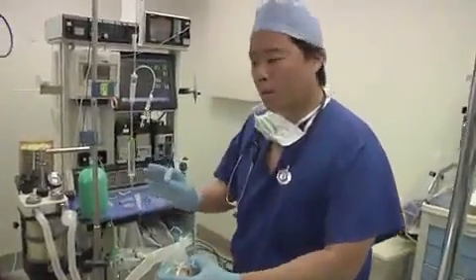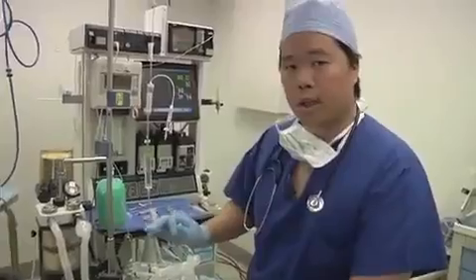Now at this point it's also important to talk to the patient so that they understand when you administer the induction agent, which in this case is propofol, they may have some stinging in their arm, and that's normal.